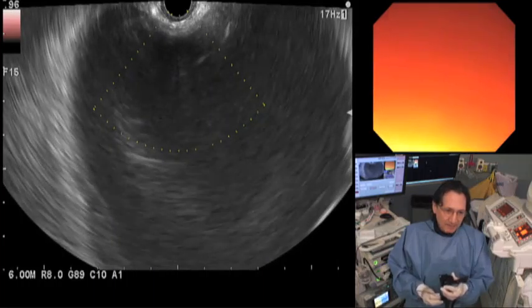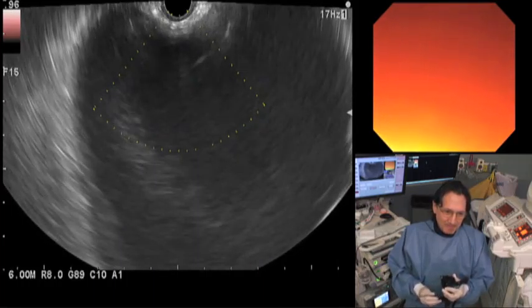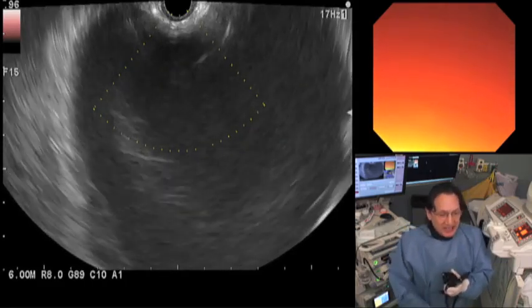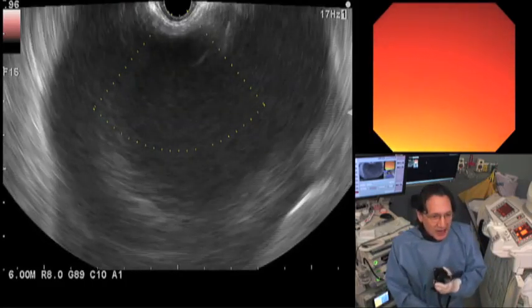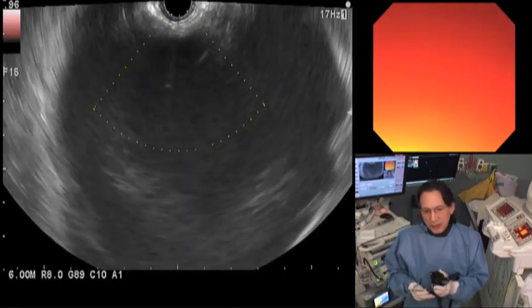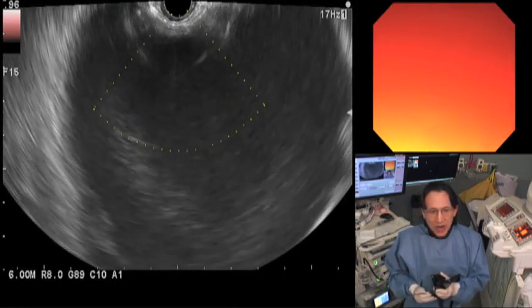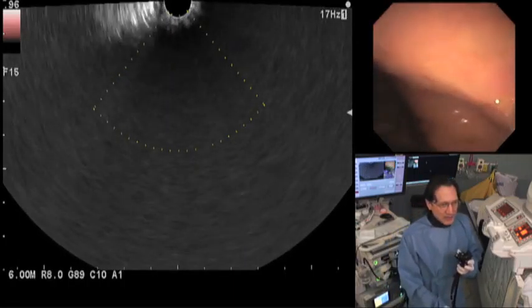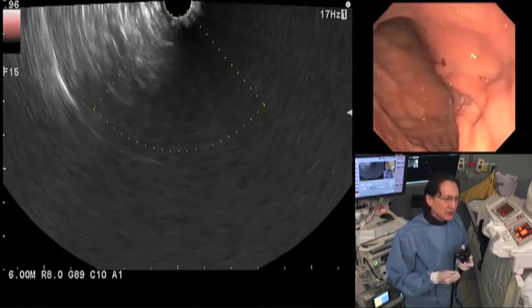Approved now? Can you use it? Yes, you can, because you're using it. Is it approved? This is approved in the United States. It's been available for a long time here in the U.S. What we do not have in the U.S. is the Endoflex, which is a smaller cystotome. And I'm going to show you what the Zimmer needle knife looks like in just a moment.